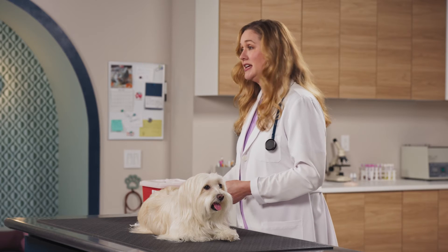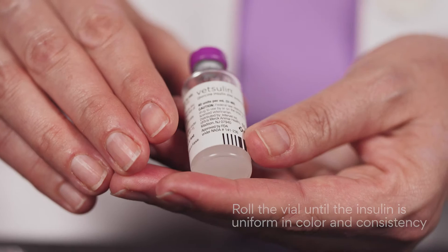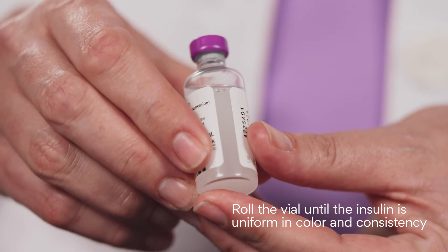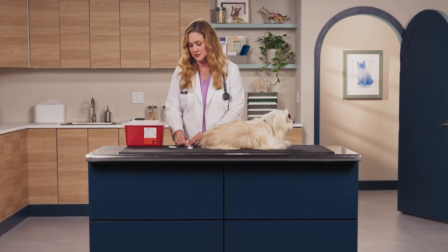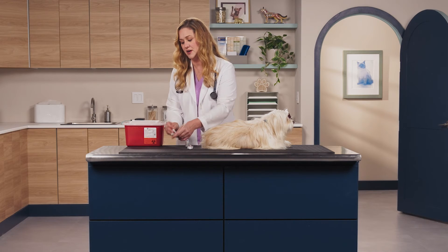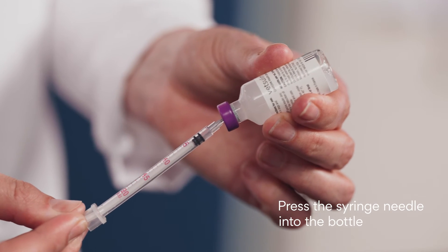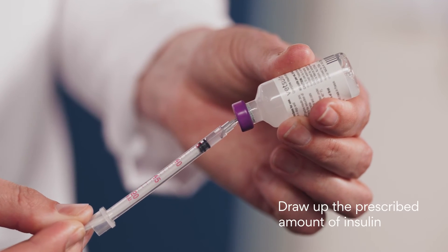First, take the vial between your hands and roll it until the insulin appears uniform in color and consistency, like this. Next, clean the top of the insulin vial with an alcohol wipe. Then press the syringe needle into the bottle and draw up the prescribed amount of insulin.